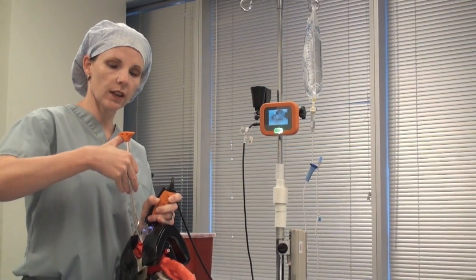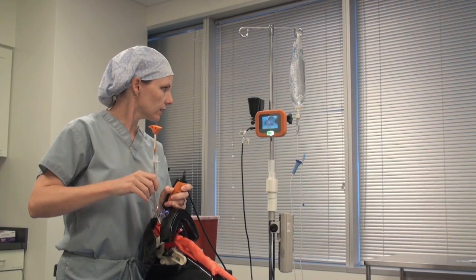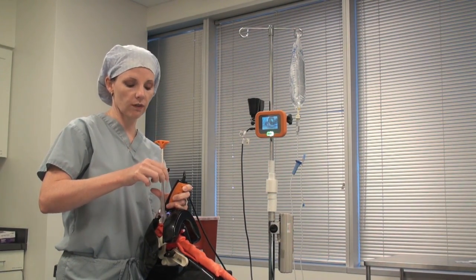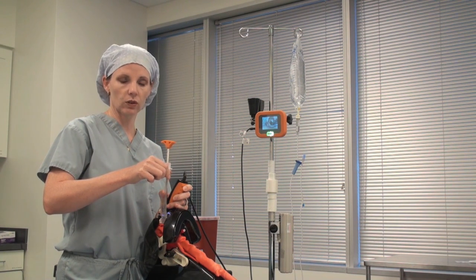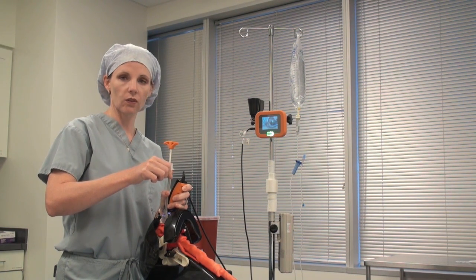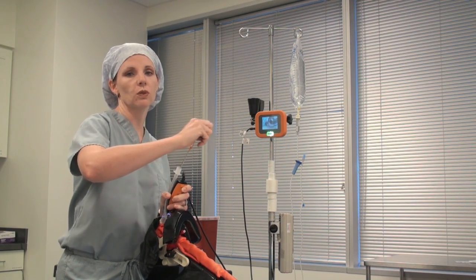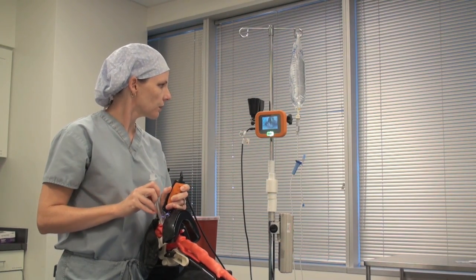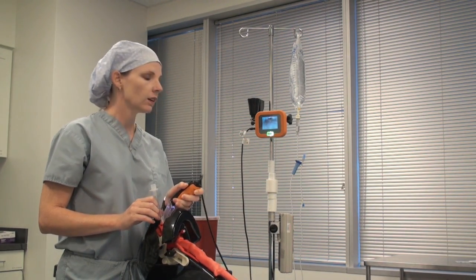Pull your rigid stylet back so that it doesn't hang out, then advance a little bit. If you want to remove the stylet yourself, you can anchor the endotracheal tube with your other thumb and remove it towards the patient's feet. Then you can confirm your intubation and you're finished.